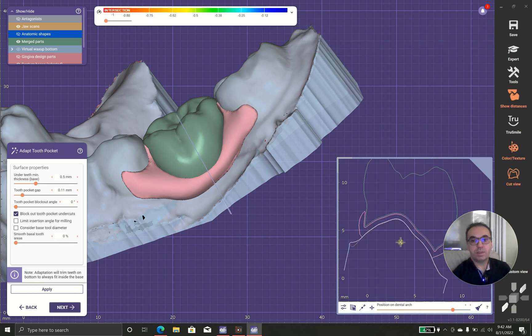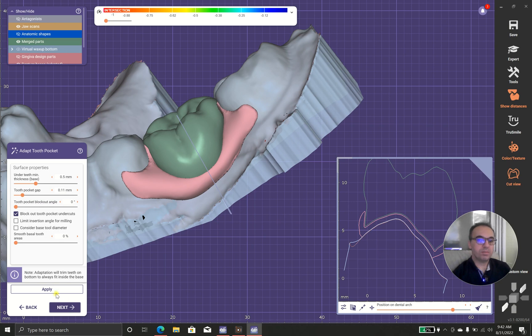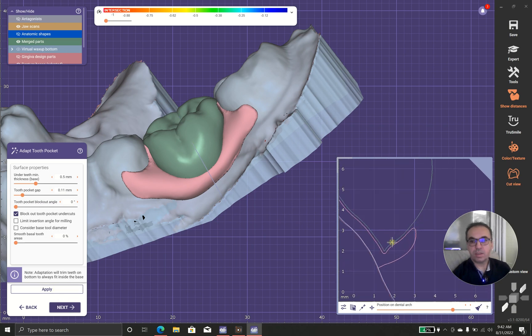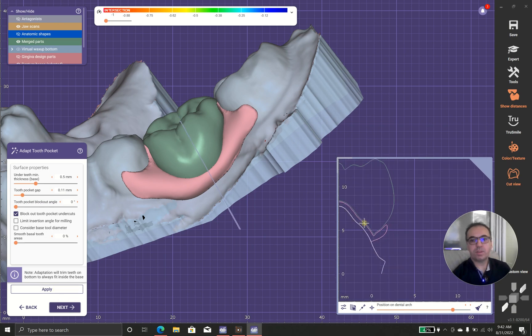And as you can see, there is a gap between the teeth and the basal part. This makes a more beautiful result.